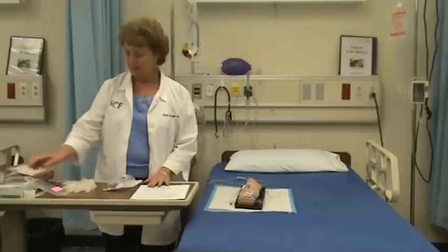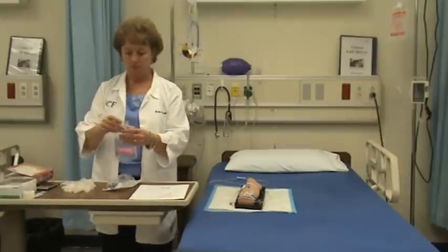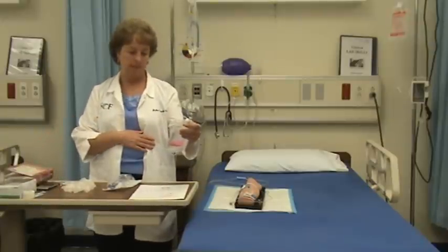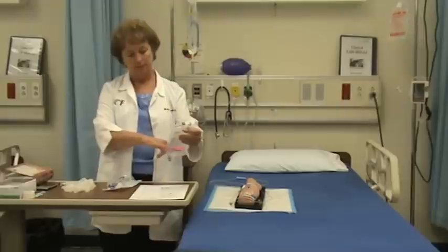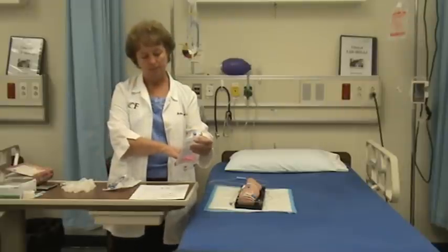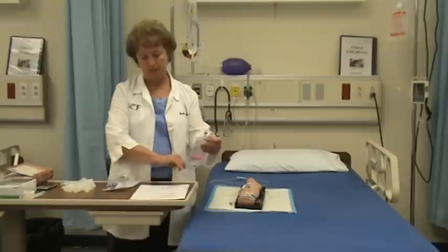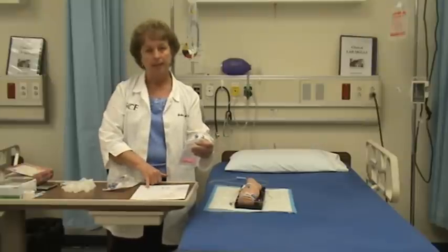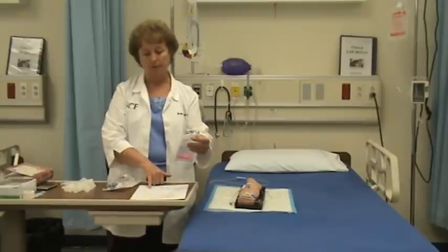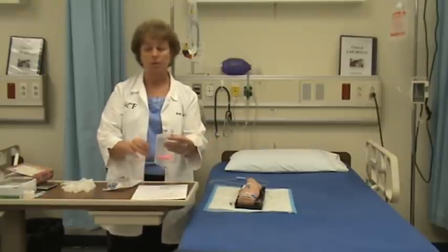I'm at the Pixis or in the medication room and I've pulled out my ampicillin. I'm checking that ampicillin 500 milligrams cross-matches the MAR and checking the allergies — especially important with antibiotics — and the patient has no known allergies.